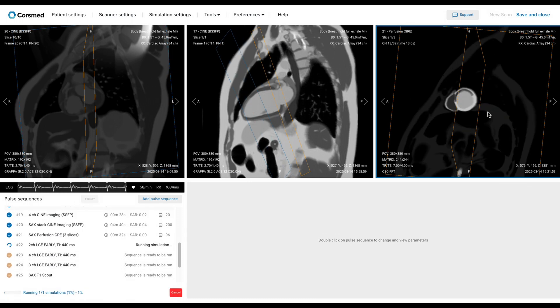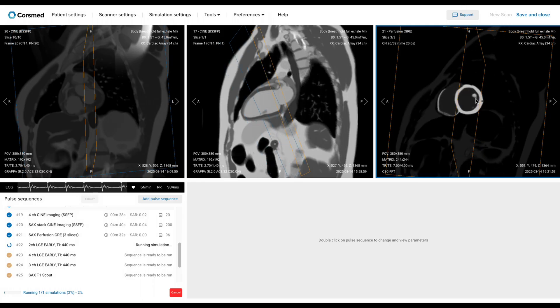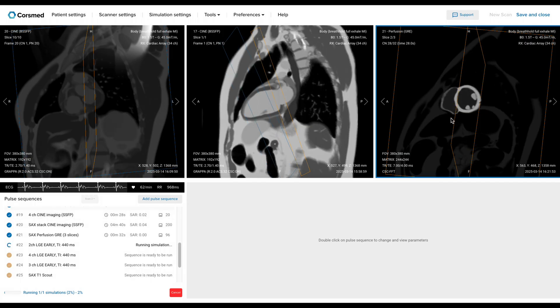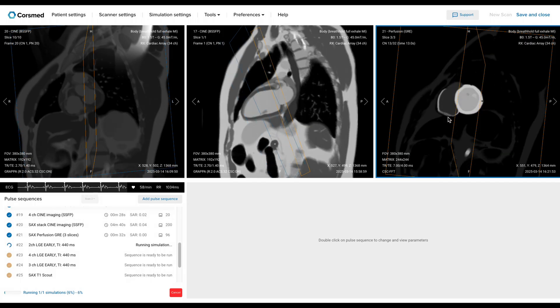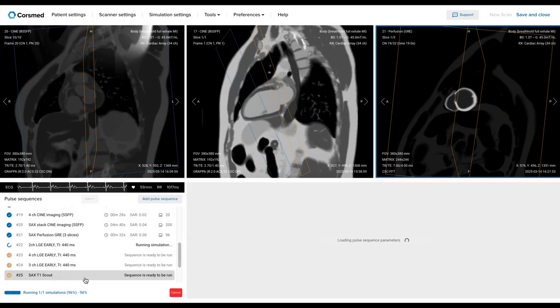As you can see here, we've just gotten our perfusion image, and we can already see a defect coming up in the apical part. We'll look more closely at this defect later on. Right now, let's move on and set up the TI scout.